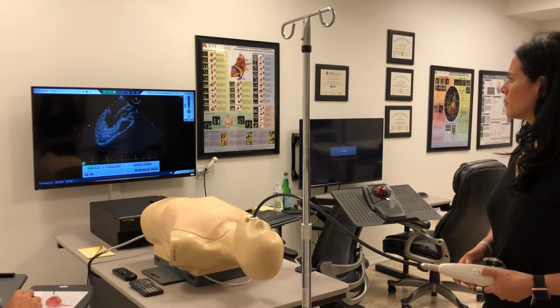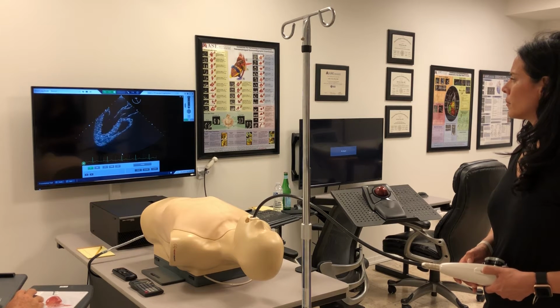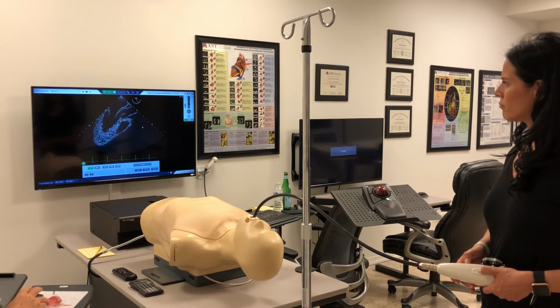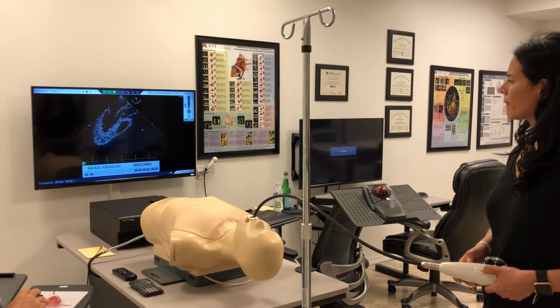And the next view we're developing is the mid-esophageal beautiful aortic valve long axis view. This view is specifically not to look at the left atrium or left ventricle, but to look at the LVOT diameter for our continuity equation, to look at the sinotubular junction diameter and the sinus of Valsalva diameter, and to look at the ascending tubular aorta for any aneurysms, dissection flaps, or atheromata. Here we don't see any. Good, let's develop the next view.